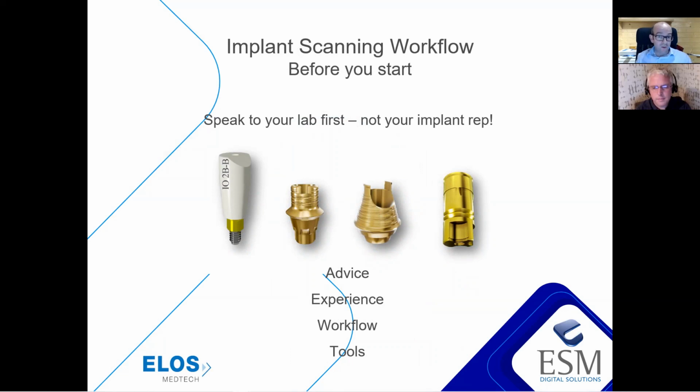The lab would most likely be working with these implant systems on a routine basis, so they'll be able to advise you. They'll have experience, they'll fully understand the workflow, and they'll have all of the tools necessary to help deliver to you the restoration of your requirement.